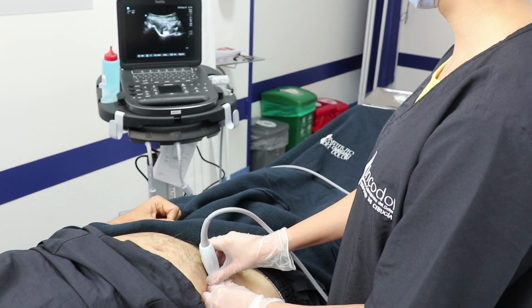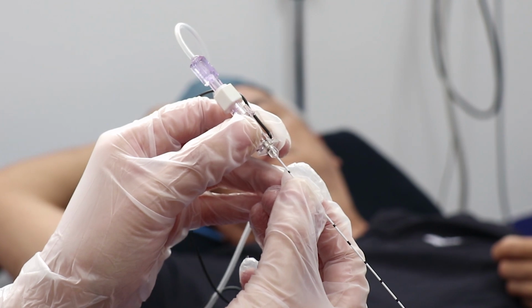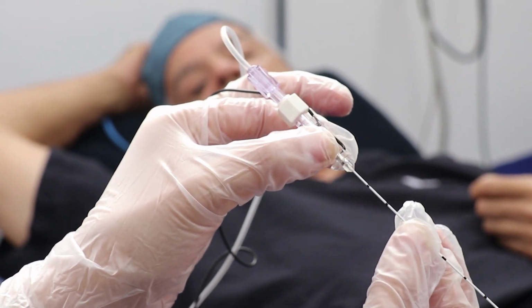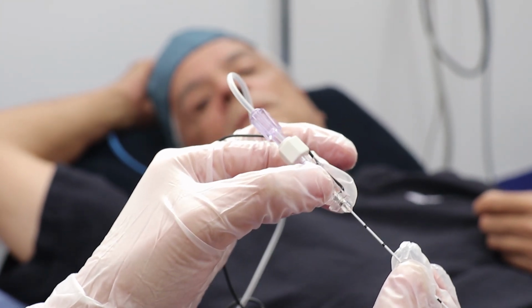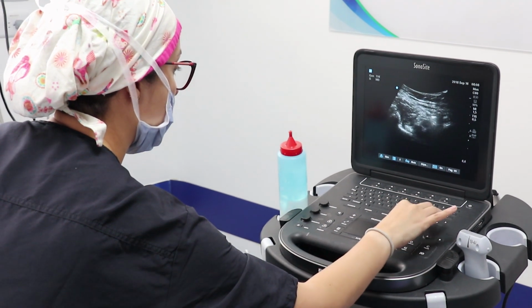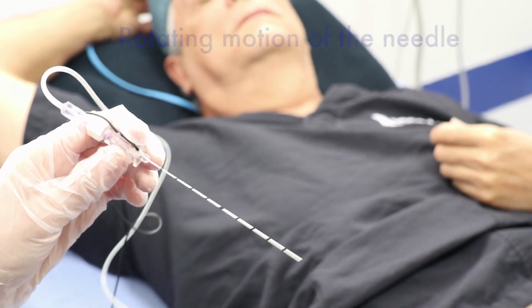The following are certain tricks to keep in mind while performing the block. If resistance to the injection is found, the following maneuvers can be performed. Adjust needle depth, as your needle tip can be subperiosteal. Withdrawing the needle slightly can change the injection resistance greatly. Alternatively, the needle does not puncture through the psoas fascia and further pushing is hindered by the pubic bone. In this case, performing a circular or rotating motion of the needle will facilitate piercing.